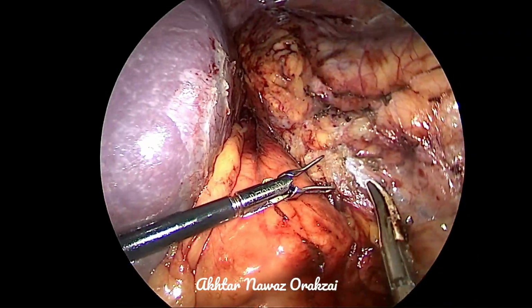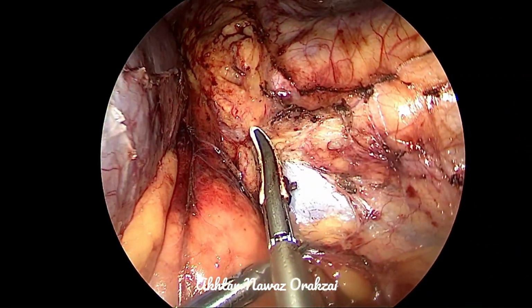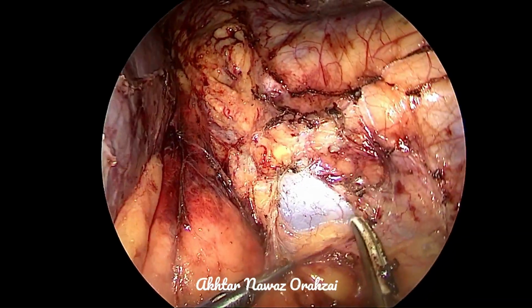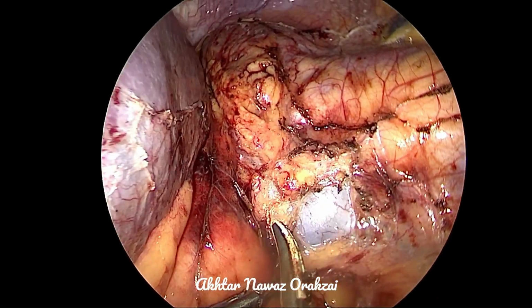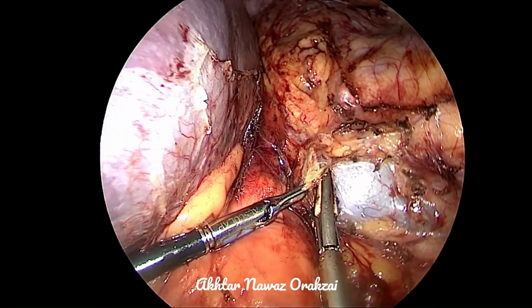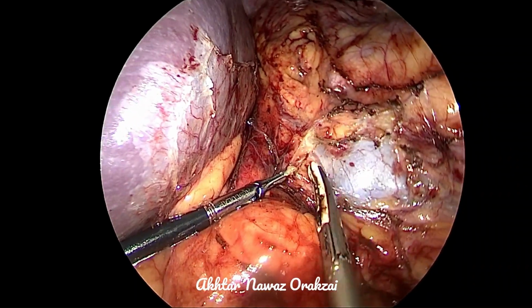As we all know that the main vein of the adrenal gland is draining into the renal vein. So identifying the renal vein will make it easy to identify that adrenal. So this is gonadal vein. You will now see the arrow will be pointing towards it. Now this is the adrenal vein.